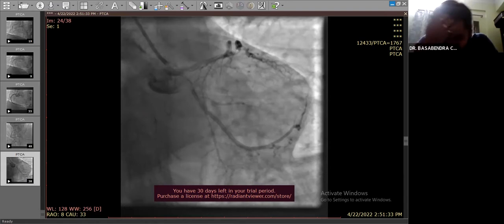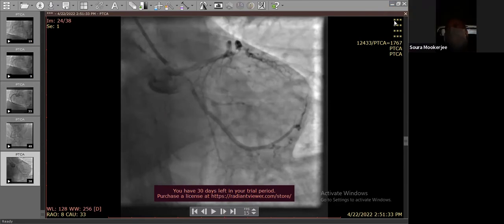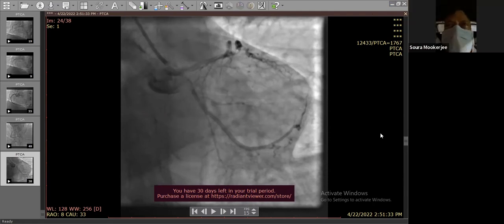So that's why we took another last shot. I think this is justified because they have inflated the balloon, though at a lower pressure. Whether it caused any problem there after the procedure, I think this is fully justified to look at. What he did was okay, because after retrieving the thing, he took a check shot. Whatever damage would have been inflicted could have been detected at that time only.